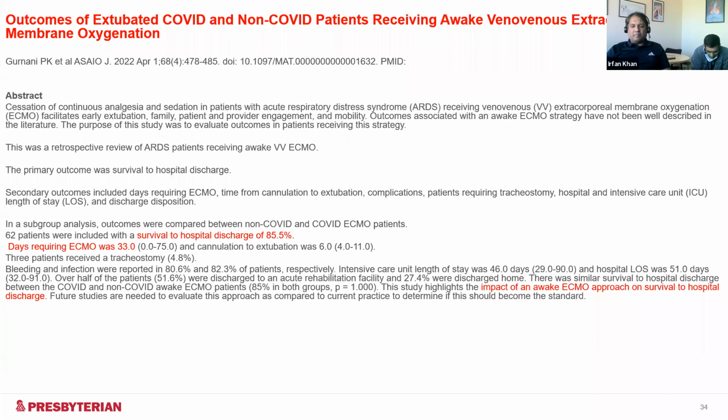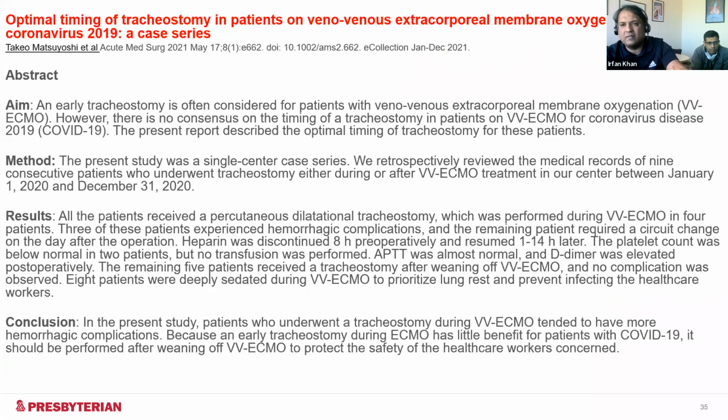Again, what they found was an impact of an awake ECMO approach on survival to hospital discharge. As you can see, these patients did really well being awake, and they were able to manage their complications really well. The question is about the optimal tracheostomy.